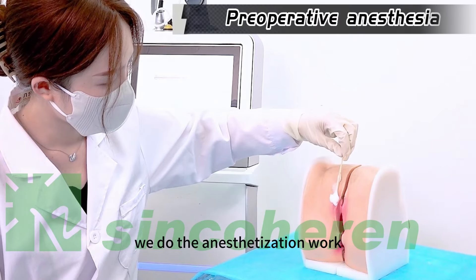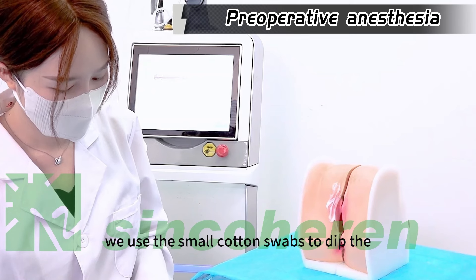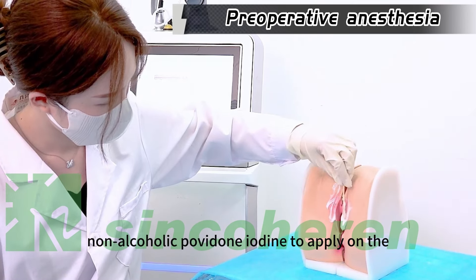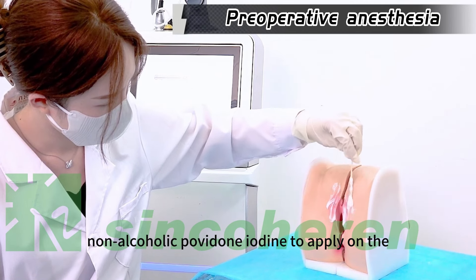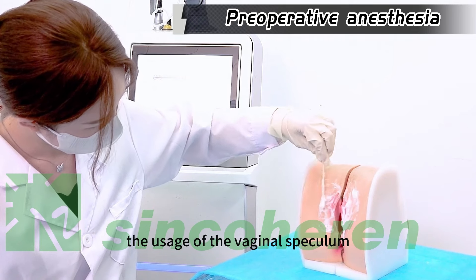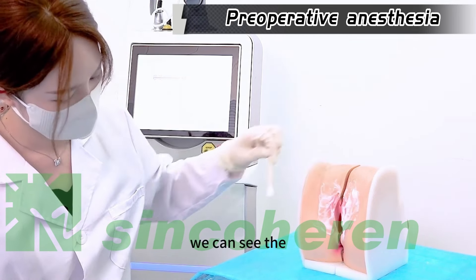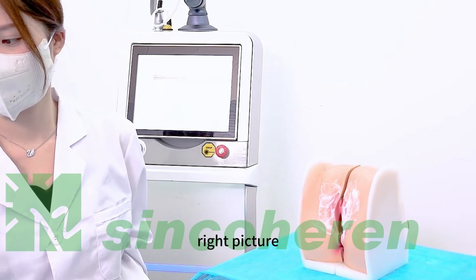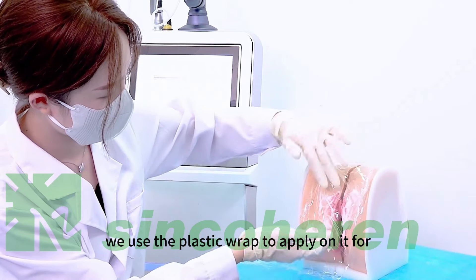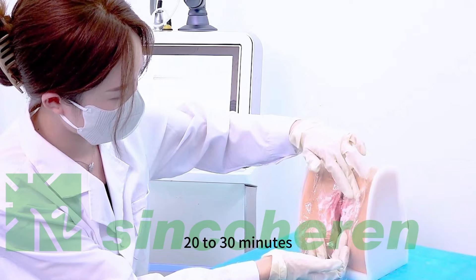We begin the anesthetization work. We use small cotton swabs dipped in non-alcoholic povidone-iodine to apply on the vagina. Then we use the vaginal speculum, and apply the plastic wrap with topical anesthetic on it for 20 to 30 minutes.